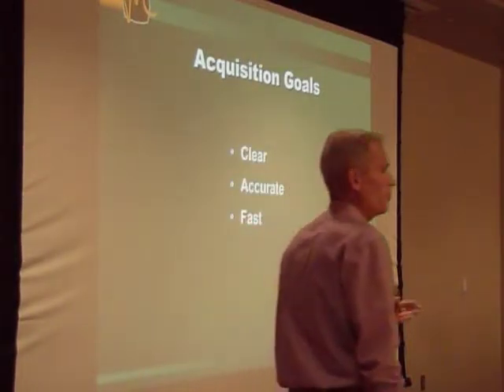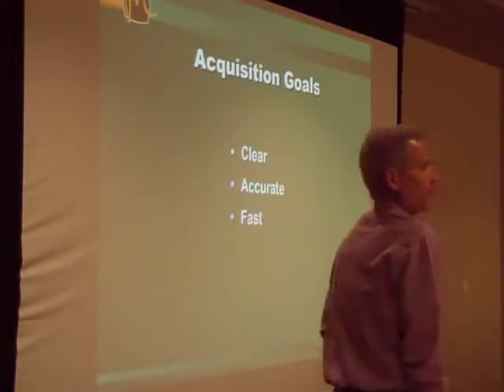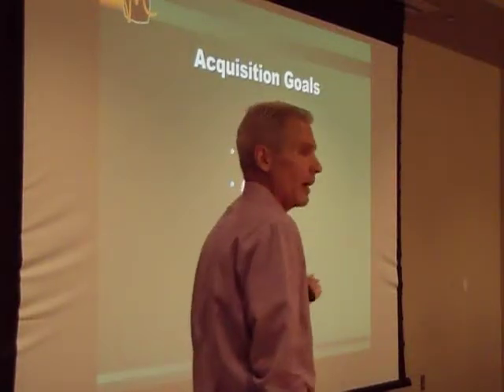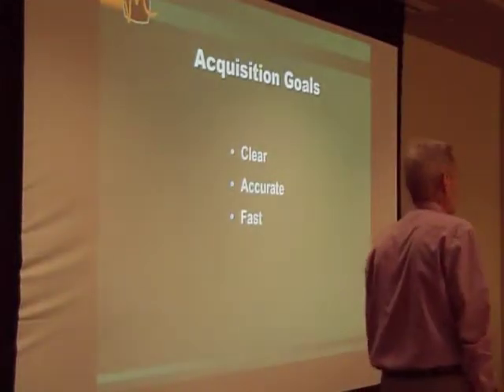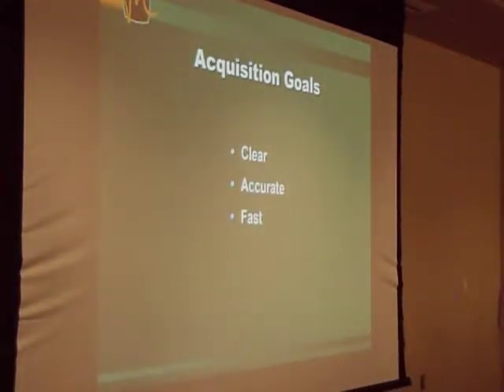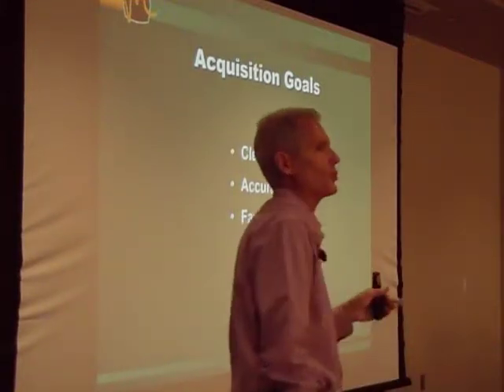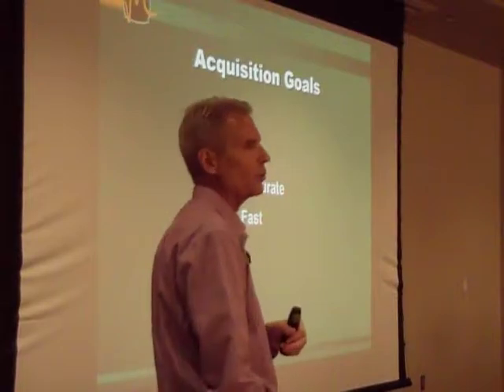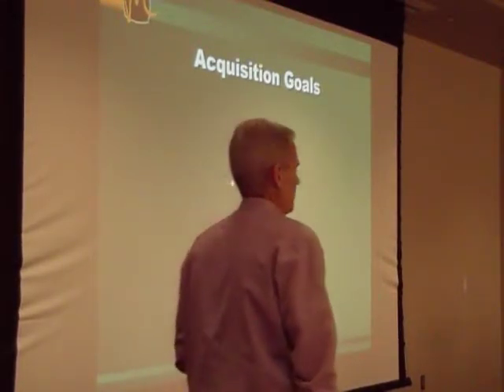Now, some of you probably are not familiar with this. I come from the era where we never did 12 leads in the field. All we did was 3-lead monitoring. So when the 12 lead came into the pre-hospital setting in the early 90s, that was a dramatic change for us. And one of the concerns back then was, this is going to take too long. Why are we doing all this? It's not really going to give us additional information. Why are we wasting our time?